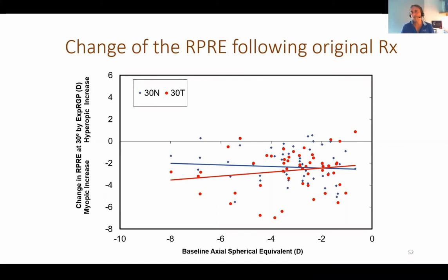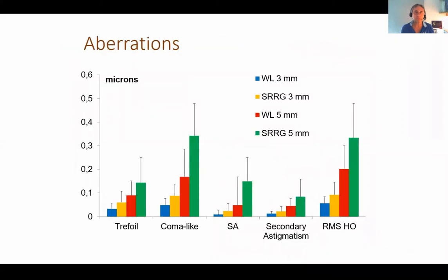This is different from ortho-K. With ortho-K at the moment, we correct around a one-to-one relationship. We say that for one diopter of myopia, it will change one diopter in the periphery, two diopters two, four diopters four. But here we can make a plus four for a child that is minus one. So we can choose the addition we want on that kind of lens. This is the beauty. And of course, that increases aberrations. That is the thing we are doing.